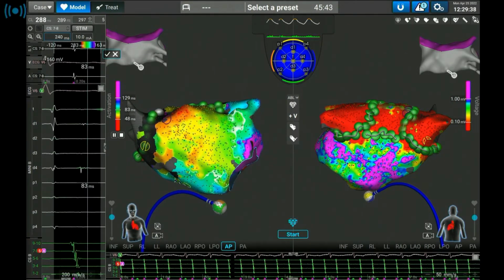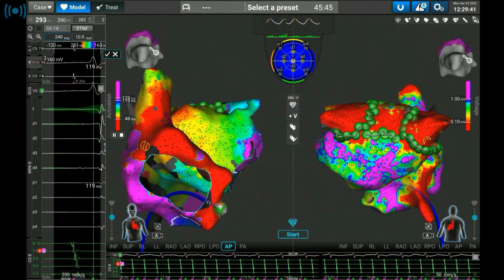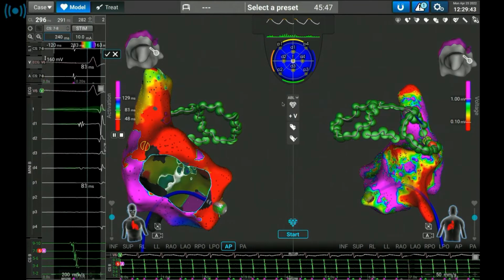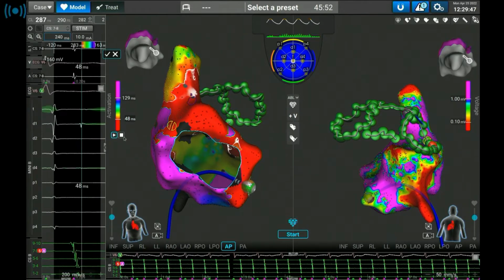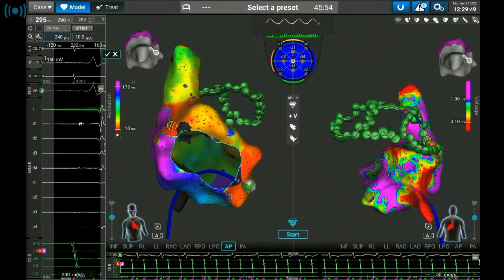So we pulled the catheter into the right atrium and made an activation map of the right atrium. And can we play this propagation? Maybe you can spread the colors.